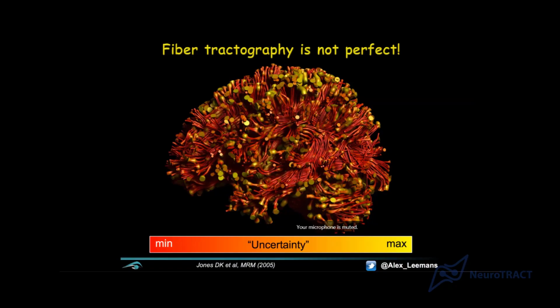It's kind of ill-defined, right? Any orientation has the same size, the same amount of diffusion. So the uncertainty goes up. So any small deviation in terms of the signal-to-noise ratio, any little bit of noise will cause dominant orientations to be completely different. So the uncertainty is non-uniform, and that's kind of an issue.